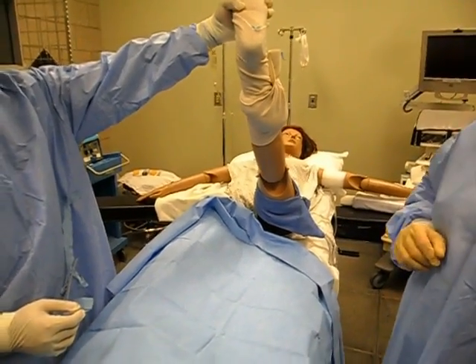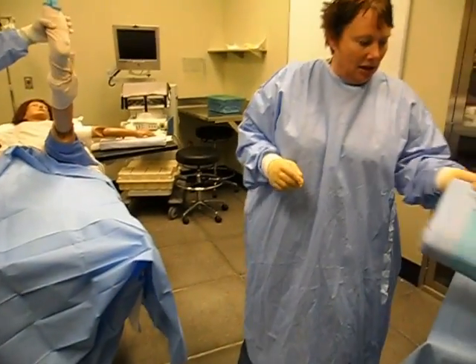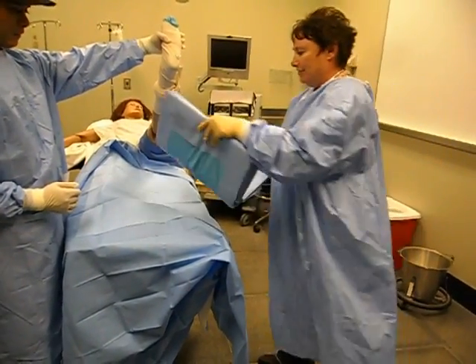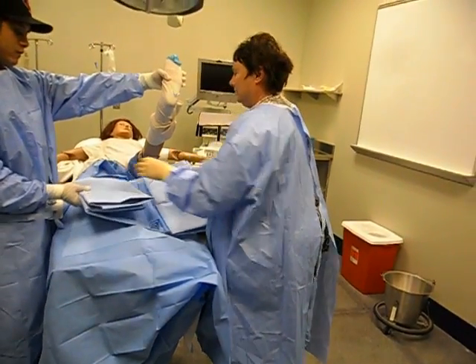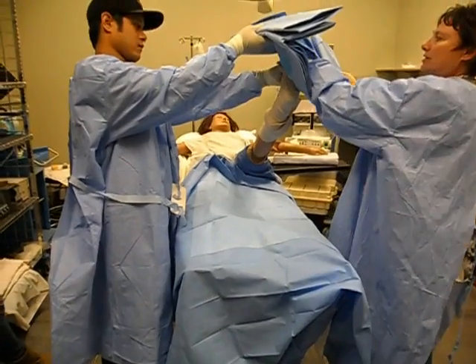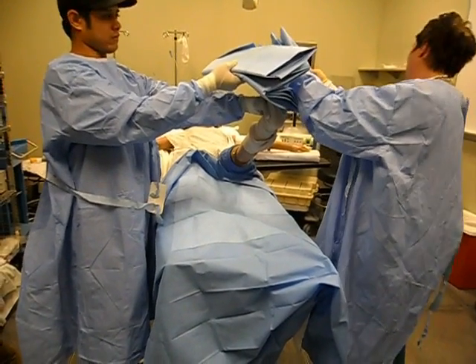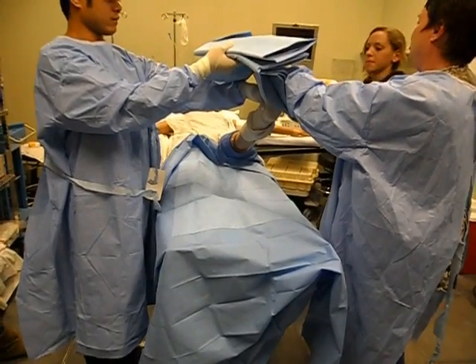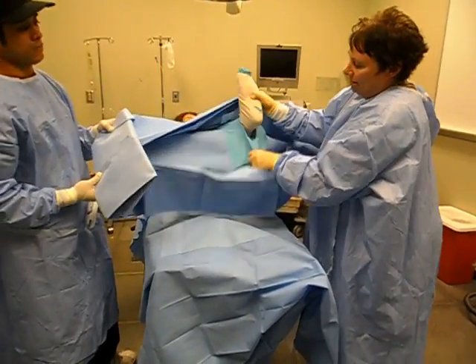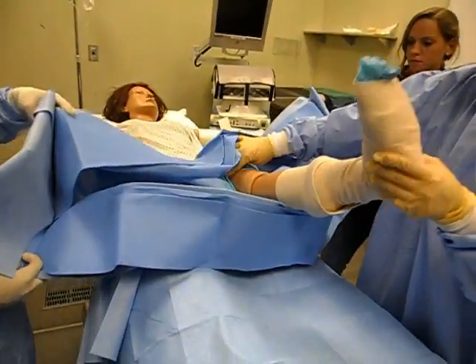Now we're going to grab our drape. If you have three people this is wonderful; with two it's a little more difficult. We're going to put it on the patient so that the head of the drape is towards the patient's head. I'll split the drape in half — I have a table to put it on now. Wettner grabs one side, I grab the other, and I want to find the hole in the drape so I need to put the foot through. We need to stretch this blue hole up and over to above where our incision is.